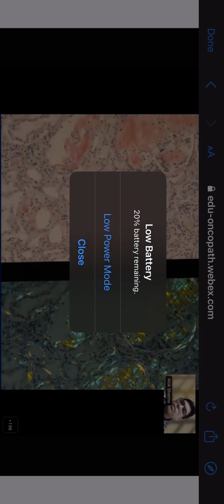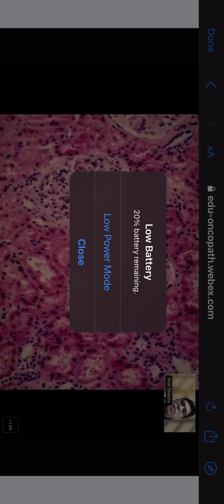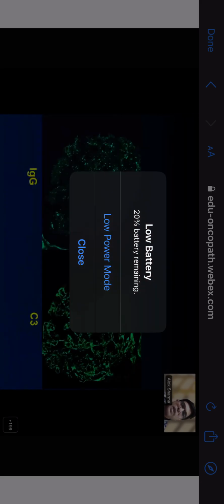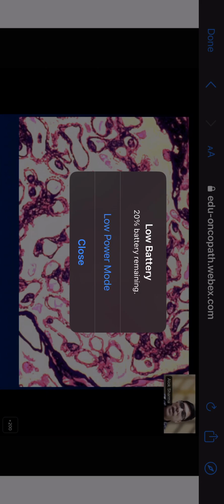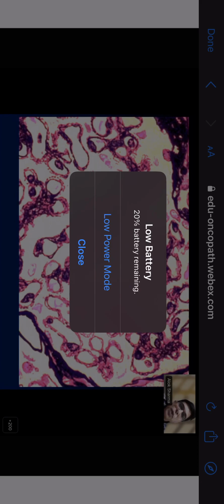So what happens in membranous? Membranous pattern is basically a deposition of immune deposits in a subepithelial location. That's what constitutes the membranous pattern of injury which I was talking about. And these subepithelial deposits are composed of antigen and antibody complexes. This is where we started off, thickened capillaries, on a PAS stain. Then we went on to the silver stain, which showed you nice spikes, emanating from the membrane, just like the hair-on-end appearance of a myeloma X-ray. And then you can see these holes and mottling. So these are membrane texture alterations because of immune complexes.